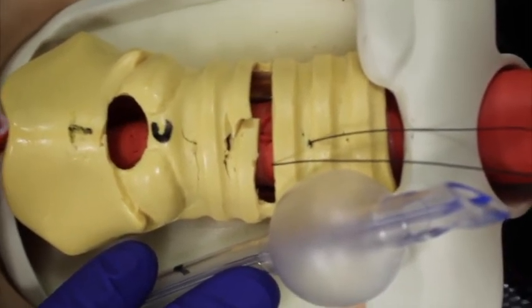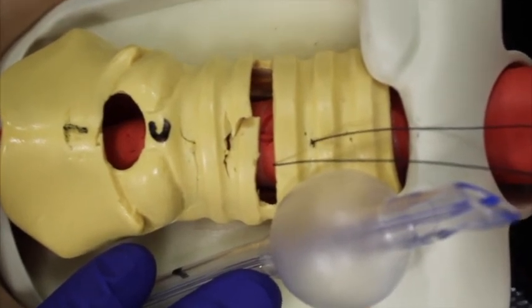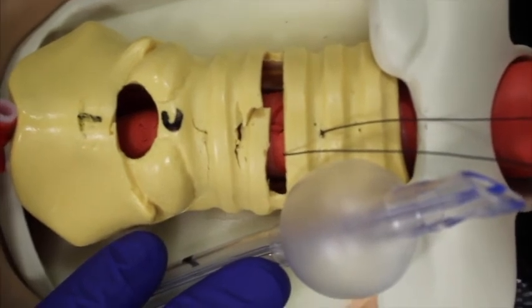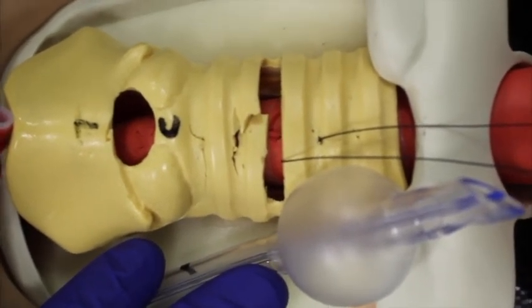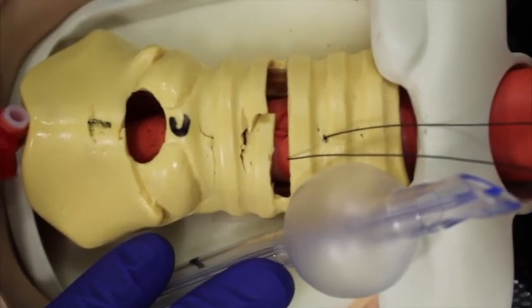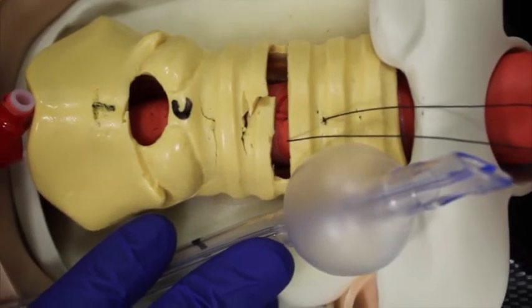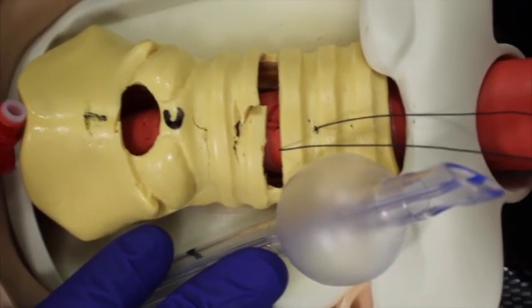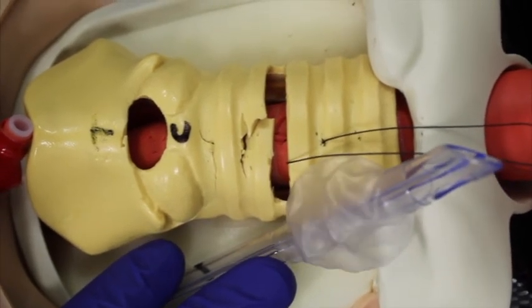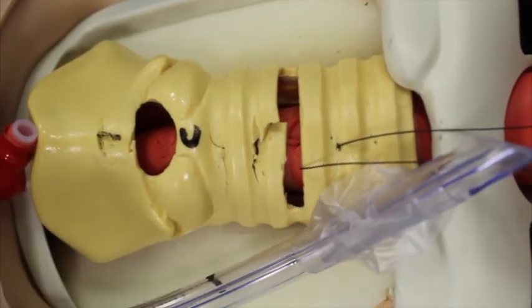to tube exchange. With clear communication to the anaesthetist, the ventilation is switched off at the end expiratory phase, with the intrathoracic pressure only atmospheric. A sturdy clamp is placed on the oral endotracheal tube and the cuff then deflated. This should not result in an aerosol into the operative field.